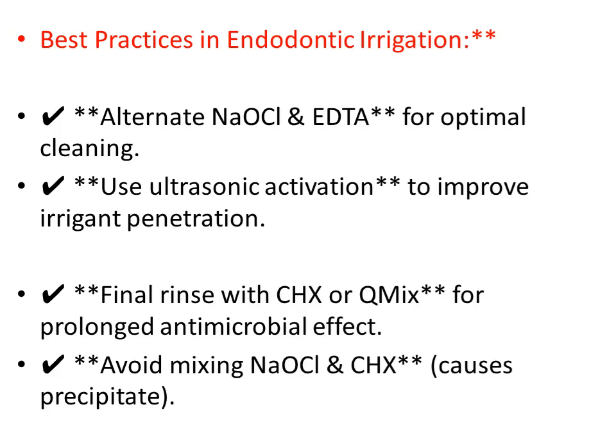So sodium hypochlorite plus EDTA, or chlorhexidine and Q-Mix, are used alternately to get better results and to make our canals sterile, getting maximum benefits without bacteria in the canals, so that our root canal procedure can be successful.